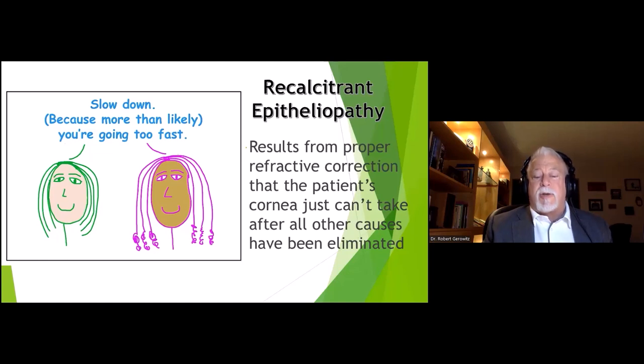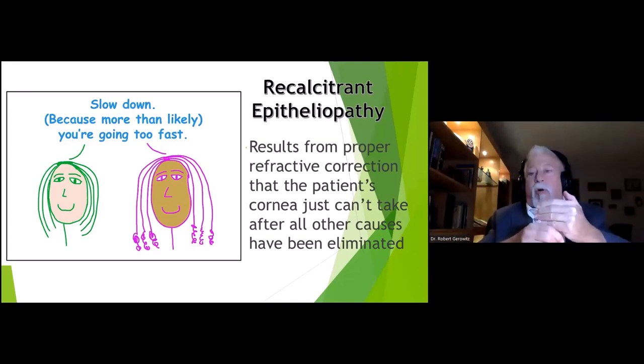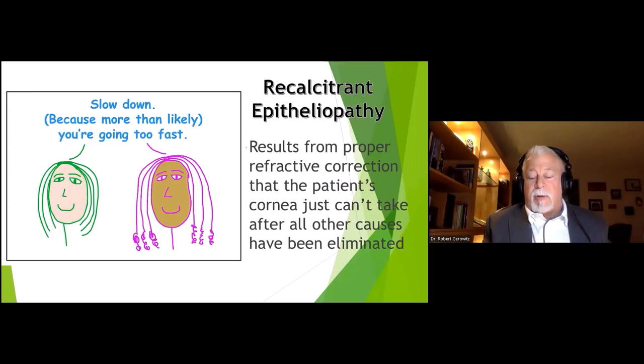Molds adhere to the cornea overnight, and just reaching in with fingertips or suction cups and removing them is like tearing off a Band-Aid. You're going to remove cells, you remove too many, and you're going to get staining. So we recommend a pre-removal artificial tear and then releasing the mold suction by pressing in at the very edge of the lower eyelid in and up to the edge of the mold. That gets everything moving and the molds come out easier.